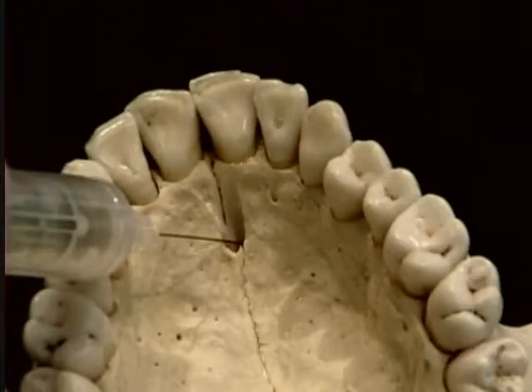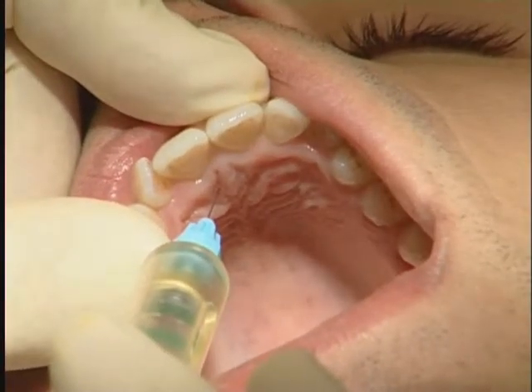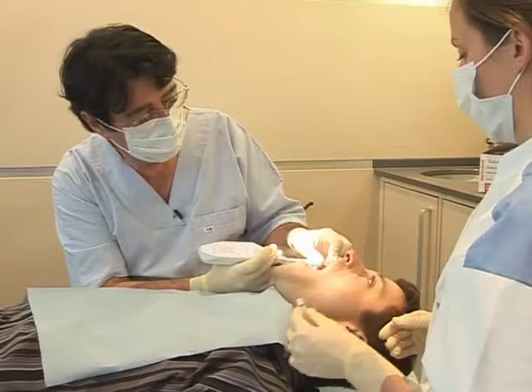The needle needs only to penetrate a centimeter, as the pressure will ensure that the solution diffuses to the nasal cavities.